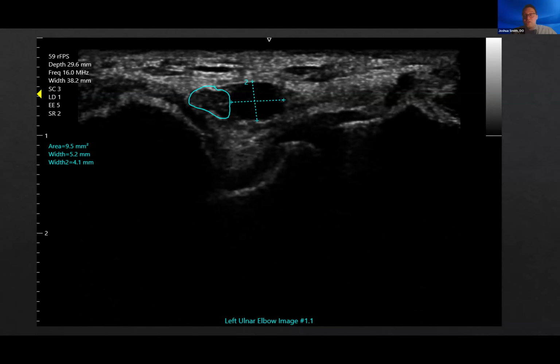And there's no way for me to differentiate that first patient from the second patient in a meaningful way without the ultrasound. You might say, well, what about an MRI at the elbow? Could I see the cyst? And you might, but there are lots of papers, especially about superficial limb nerves, showing that with current technology, ultrasound tends to have much better spatial awareness and recognition than even MR neurography does. It's also way cheaper and easier.